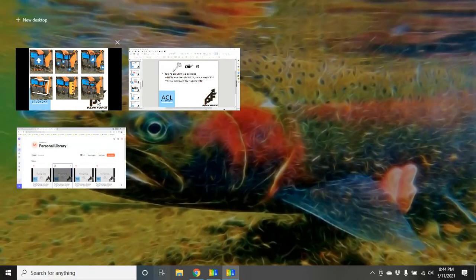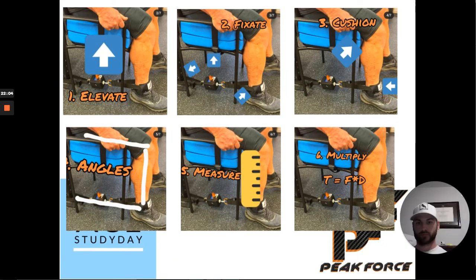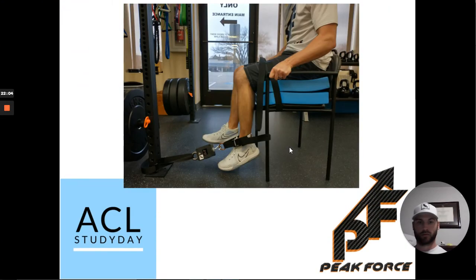And the reason that's important is we want to, well, we'll talk a little bit more about why that's important, but first I want to just highlight quickly what the hamstring test looks like. Basically, you just flip the chair around and you're doing the exact same thing. Now, if we're going to get picky about this test, we would say that the fixation point over here is not ideal. That needs to be up a little bit higher so that we can be more perpendicular to the tibia like we discussed earlier.